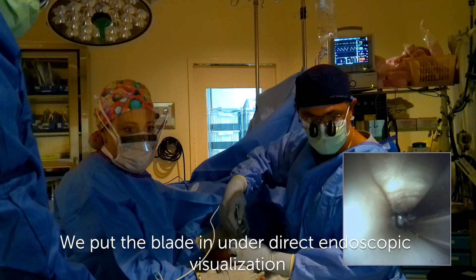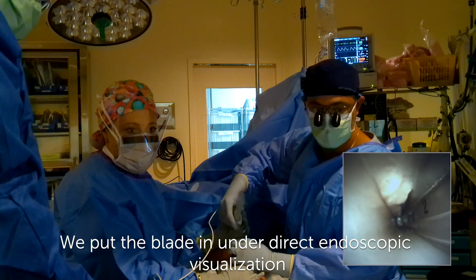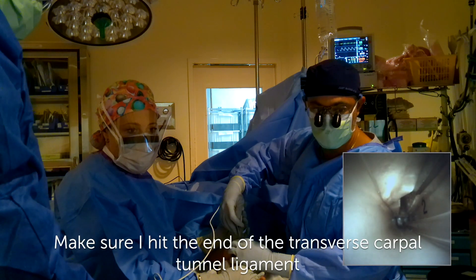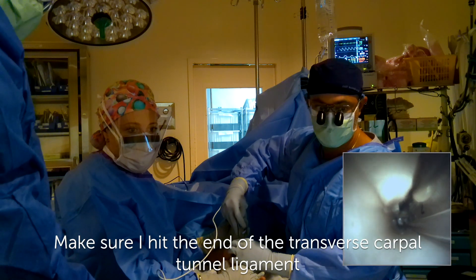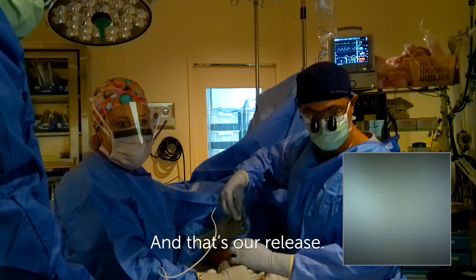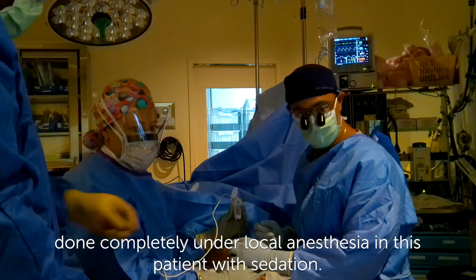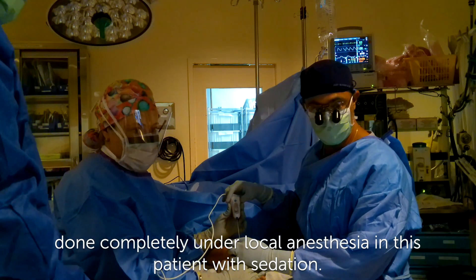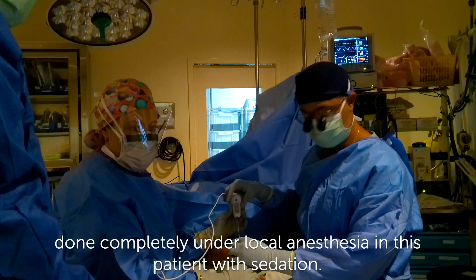We put the blade in under direct endoscopic visualization. Make sure I hit the end of the transverse carpal ligament. And that's our release. You can see that our tourniquet time is two minutes. Done completely under local anesthesia in this patient with sedation.